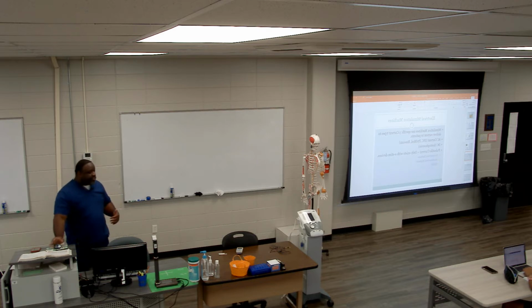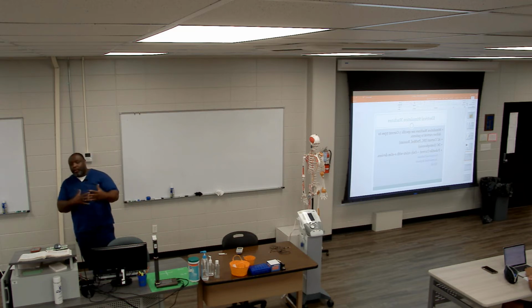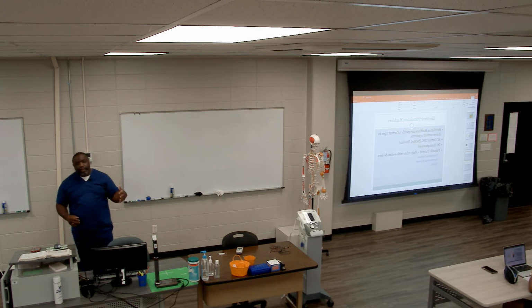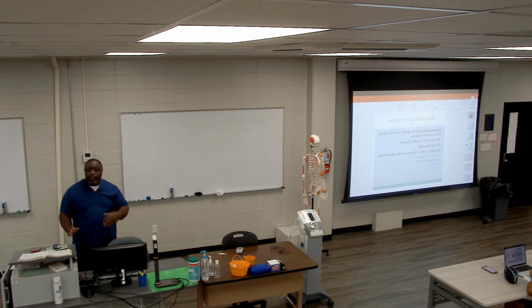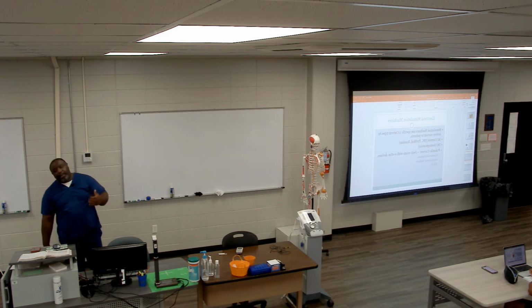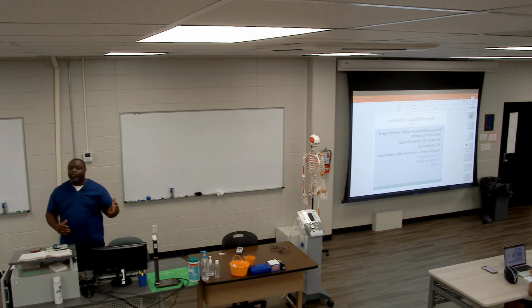As it relates to the machines themselves, they use the same names of current that we are already familiar with, like direct current and alternating current. We use a direct or alternating current to power on the device, and once it's powered on, the device produces either a direct or an alternating type current for the treatment of the patient.